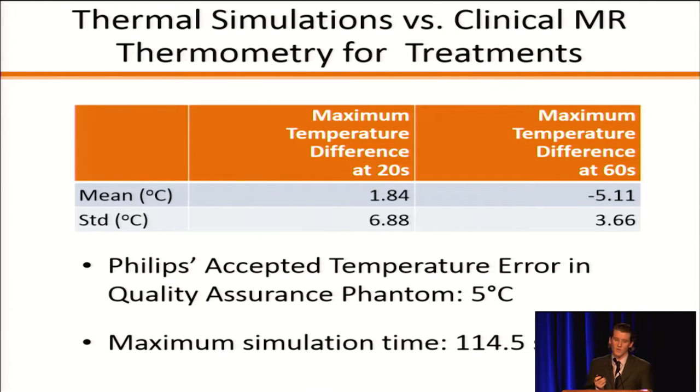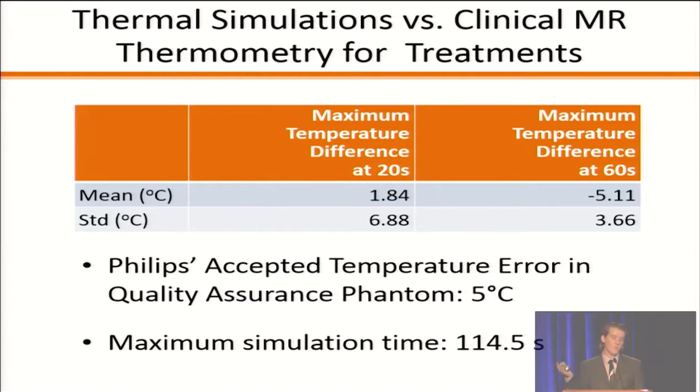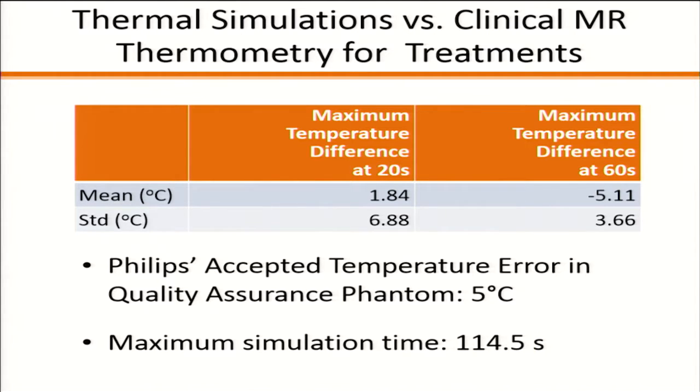Looking at the simulation time, the maximum for all the sonications simulated was 114 seconds. So based on the average preoperative MR acquisition time of 5 to 10 minutes, we can fit multiple simulations within one acquisition, which means this is clinically feasible.